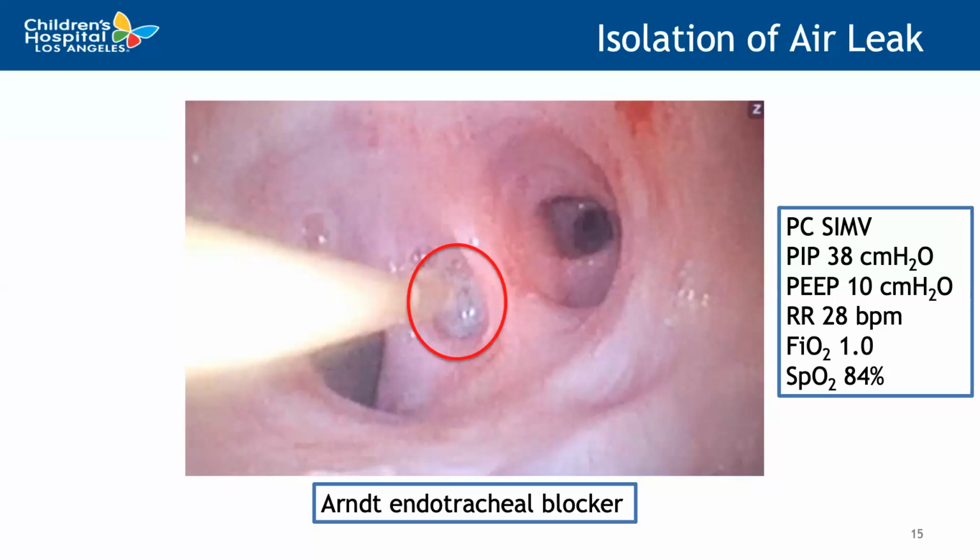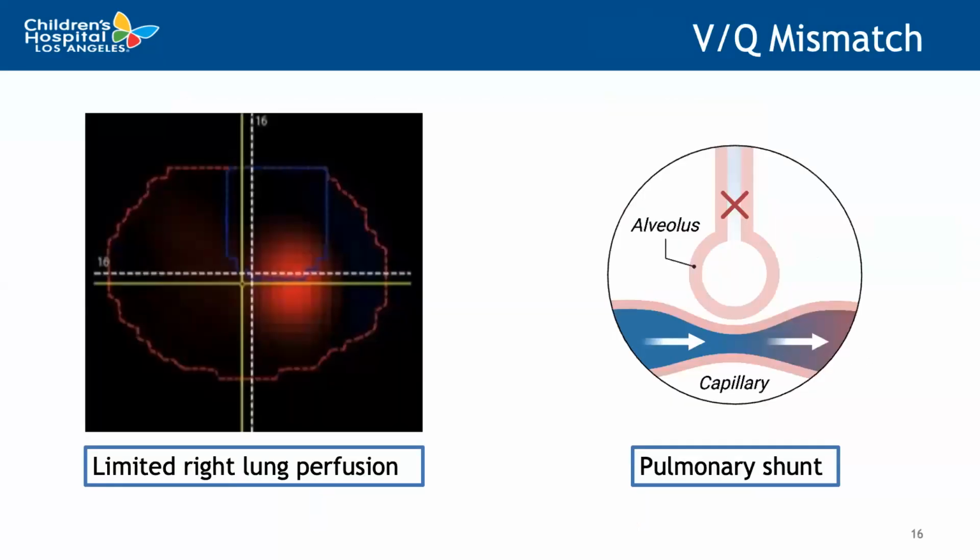And the question became what was happening on that side of the lung, and maybe what was happening specifically with perfusion. Lucky for us, EIT does have an ability to see lung perfusion. We are able to do this via an offline analysis, which is called the pulsatility feature.